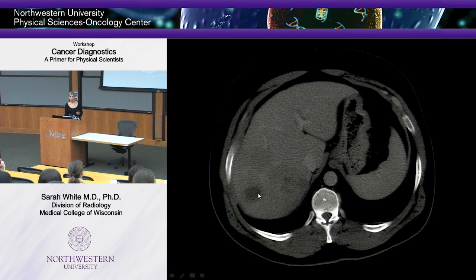Okay, so does anyone see anything that doesn't look like the things surrounding it? So this, right? There's a black hole in the middle of the liver. What's that? Okay, that's what they said. Well, what's that? He's 34. Is this normal? It doesn't look normal, okay? You can have benign things that we know after looking at these CT scans for years and years and years that are normal, and you had them as a child and it doesn't matter. But this doesn't look like that, okay?